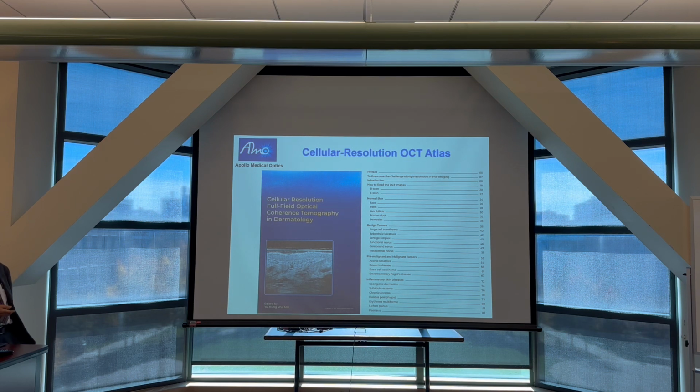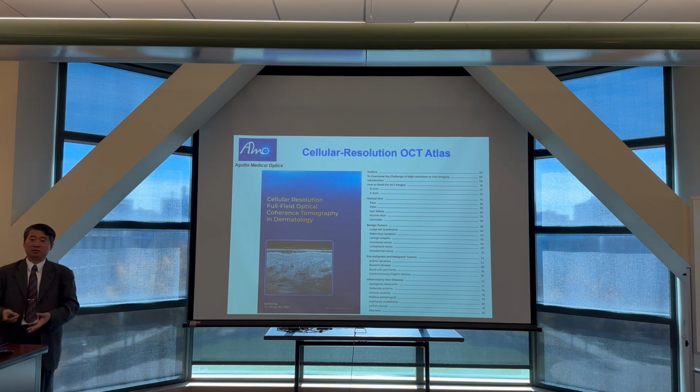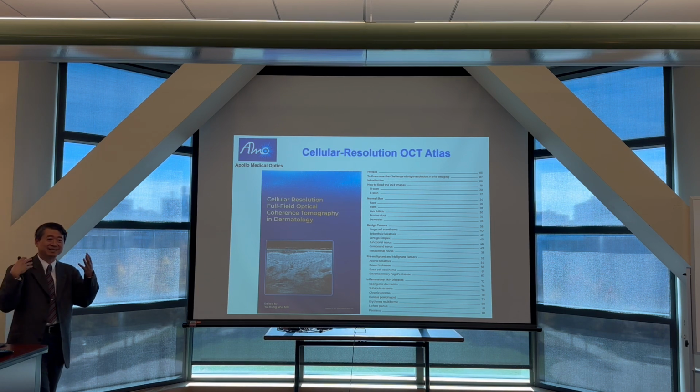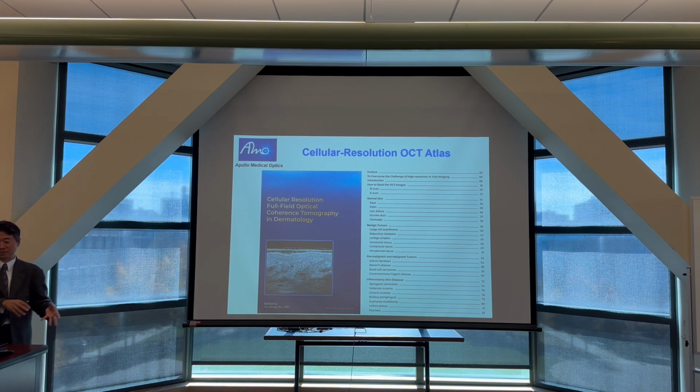Right now, remember we have a clinical trial for about 200 patients. Within these 200 patients, there are about 20 different diseases. So we make an atlas, so that for each of the patients, we collect all the 4 imagings. Actually we have a PDF file for this atlas. So in case you're interested in OCT, I can send you a copy so that you know, for all these different skin-related diseases, what is the HE stain, what is OCT, what is the clinical imaging, and dermoscope.